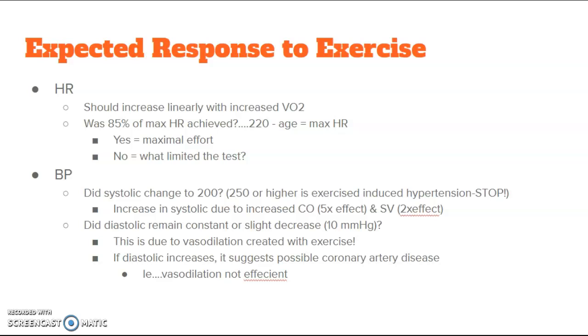Did they say, I'm short of breath, so you stopped the test? Did they complain of chest pain, so you stopped the test? Did they have a sore knee, so you stopped the test? Because based on that, you're going to want to correlate those two items.